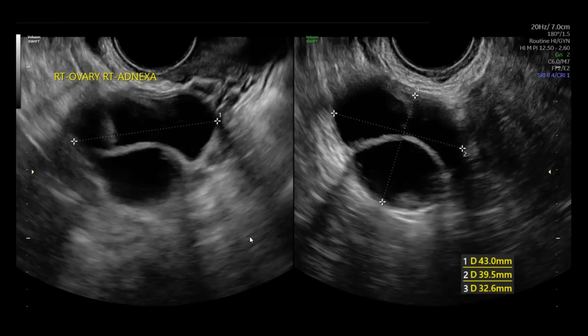I think what my sonographer is trying to measure here, in comparison to what was measured earlier, is more of just what is the cyst versus what is the ovary. But for what it's worth, from my perspective, when the ovarian cysts are really encompassing the vast majority of the ovary, it doesn't make that much difference to me to extrapolate that the measurement of the ovary is the measurement of the cyst or vice versa. Sometimes I'll qualitatively describe that the size is the same, but there is a sliver or a crescent of normal ovarian tissue surrounding that cystic mass.